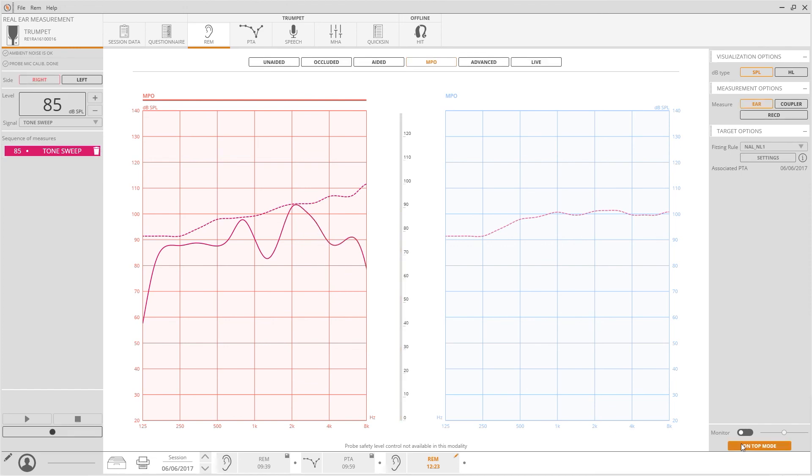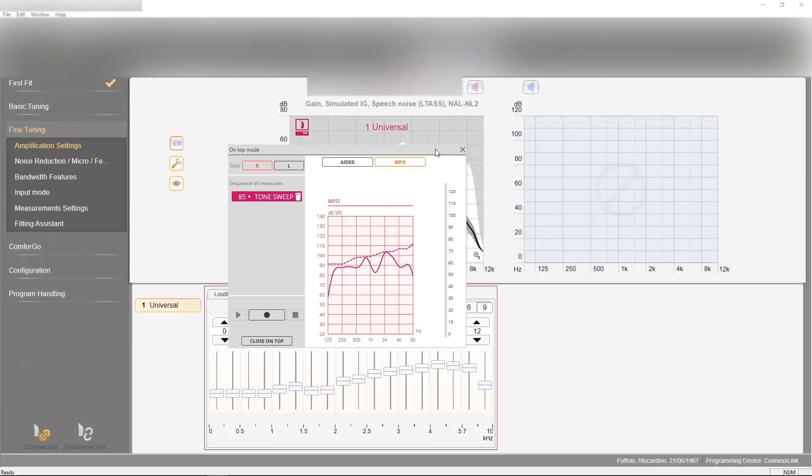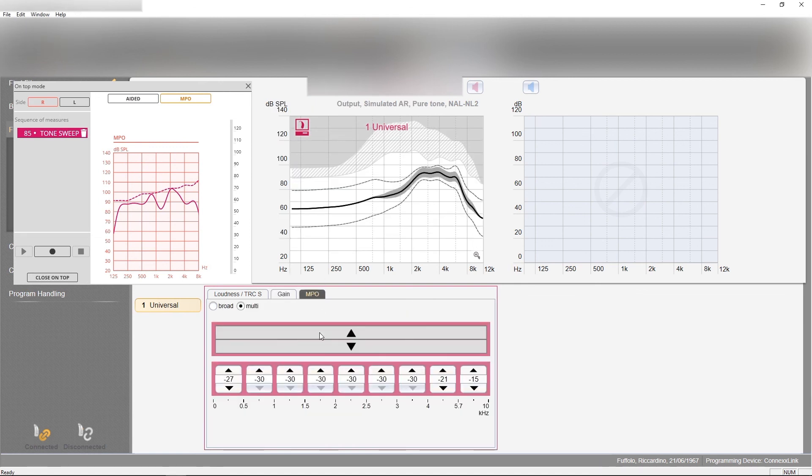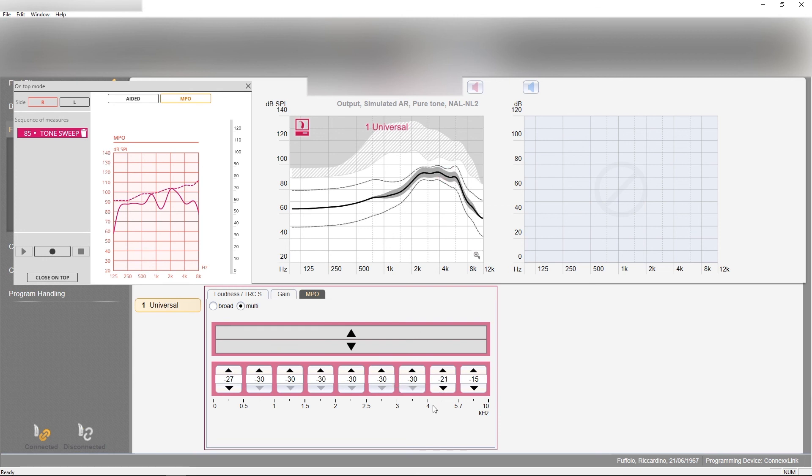In MPO, it is also possible to select the on-top mode and easily modify the hearing aid parameters to avoid crossing the discomfort threshold when the tone sweep is produced.